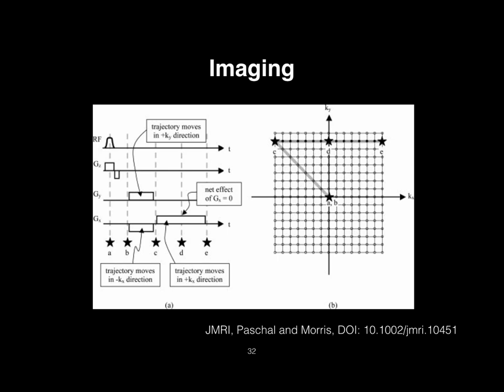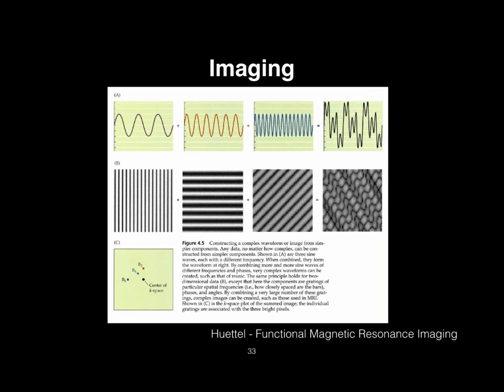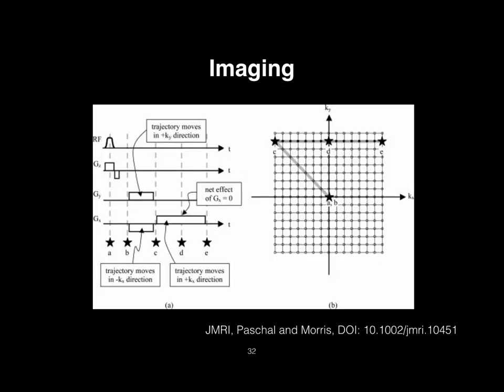All right. And physically, the first time that I was trying to get this to gel and to have some intuition of what it means, this was one of the pictures that actually helped me come to the realization of what all this means. So again, if we picture this as our k-space, essentially this grid here.